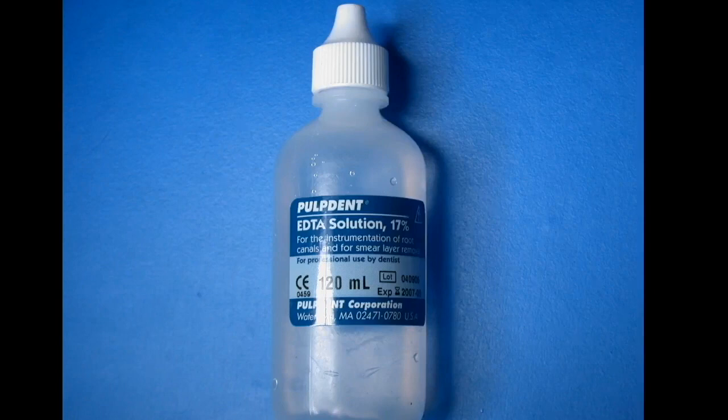So EDTA is an inorganic solvent, so it will remove those little particles by dissolution that are in the tubules, and we put that in there for 4 minutes, and then we rinse that out. And once we've done that, then we can go in and put our bone graft in after we've flushed that and dried that area.